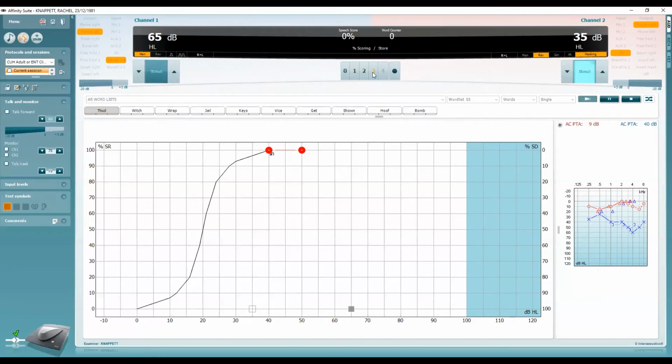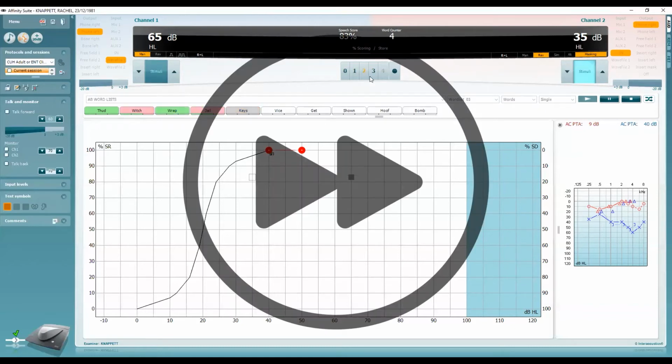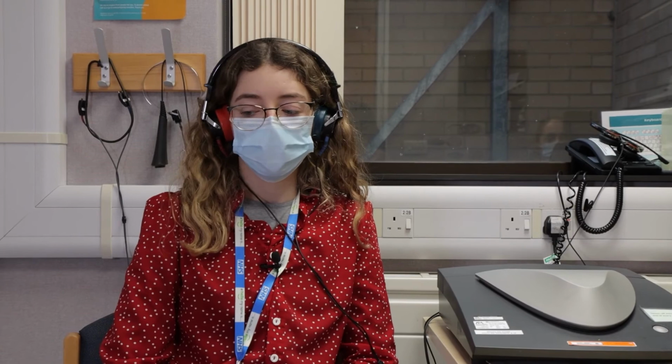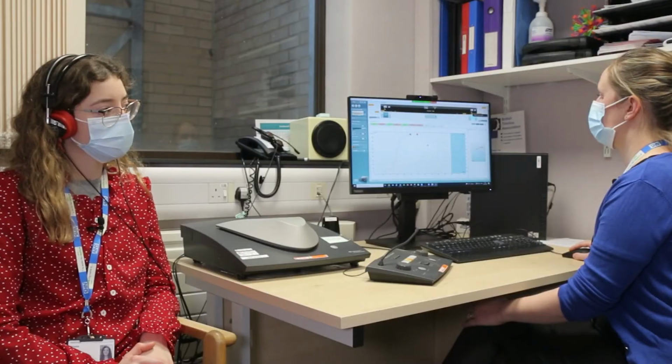Third. Mitch. Okay, so this time the patient has said Mitch, so we've missed off the W sound, but we got the I and Ch, so that's a 2. Wrap. Can't hear. Okay, so my patient didn't get that one at all, so we're going to score that as a 0.